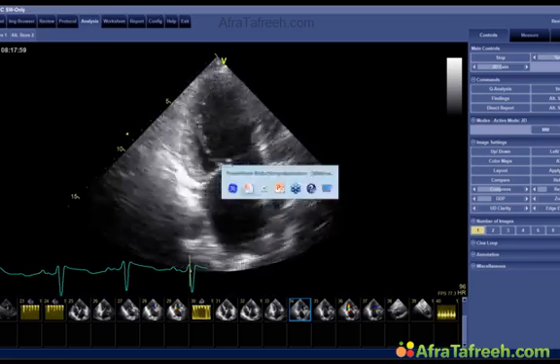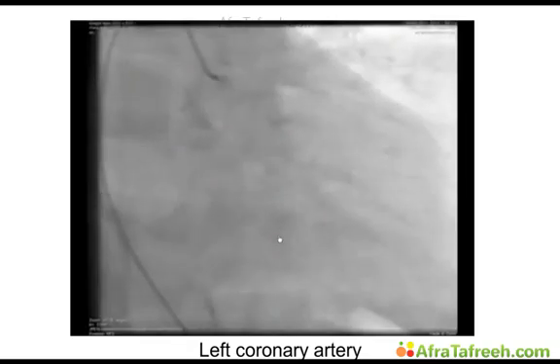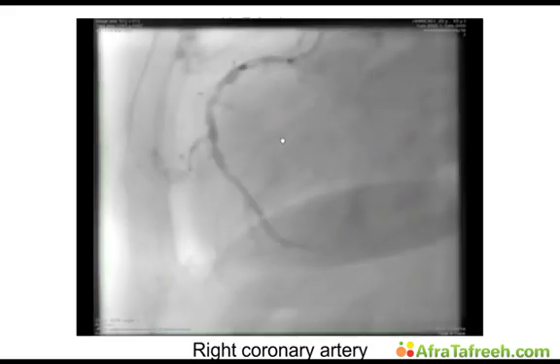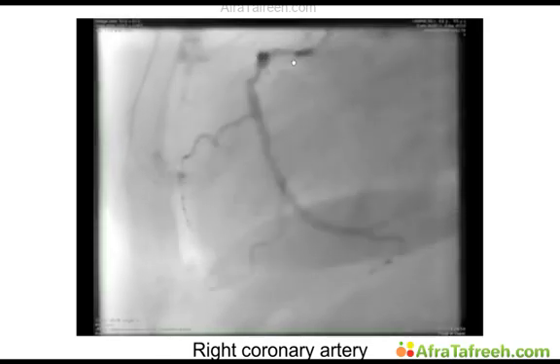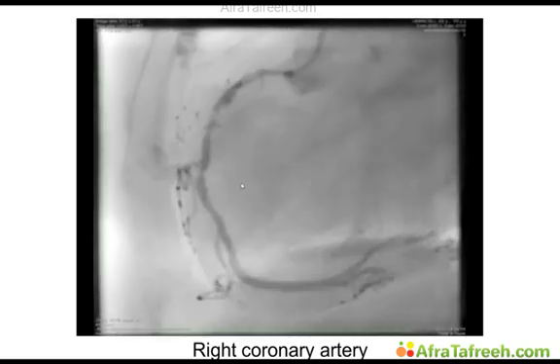To prove that this is true, I'll go back to the coronary angiography. Here is the left coronary angiogram. We have fairly nice vessels of the left coronary artery. There are just minor abnormalities, but there is no stenosis. Now let's go to the right coronary artery. Okay, and what we find is a terrible right coronary artery. If you look closely, you see that there is an ostial stenosis, which is almost subtotal. She has almost completely occluded right coronary artery. And then we have a lot of different abnormalities of the coronary arteries as we go down towards the middle. And it's also a very large right coronary artery.